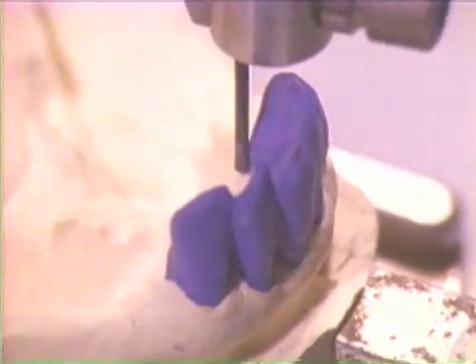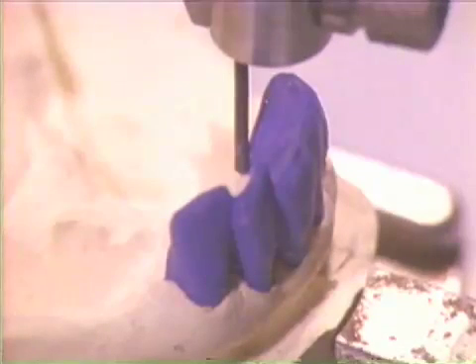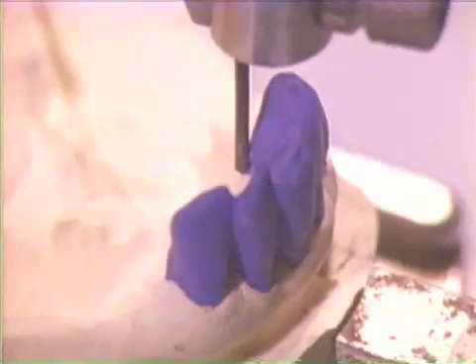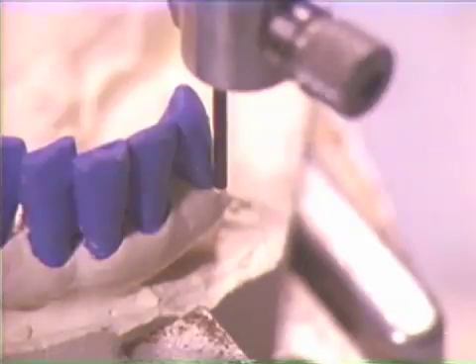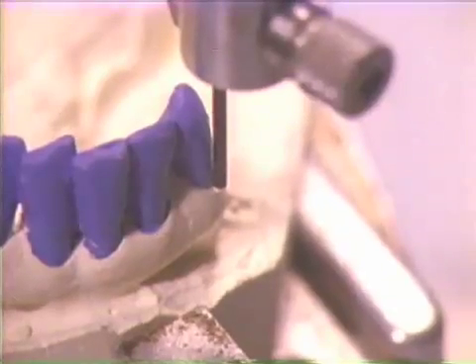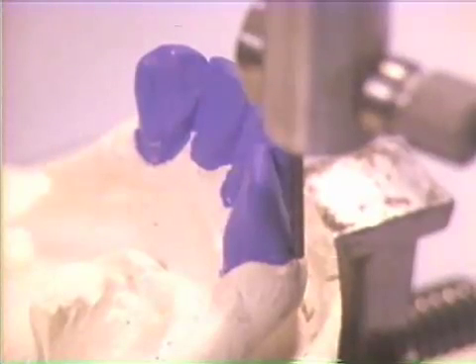The third presentation in this program will demonstrate how removable partial denture abutment teeth may be recontoured in order that they provide favorable guiding planes, retentive undercuts, and vertical stops. Survey of the mandibular left cuspid and right lateral incisor indicates that these teeth have too little lingual surface area and facial undercuts for providing lingual guiding planes and facial retention. Additionally, these teeth require cingulum rests for vertical stops and correct force distribution. With the aid of a surveyor and the patient's cast, the desired contour changes are waxed onto these abutment teeth.